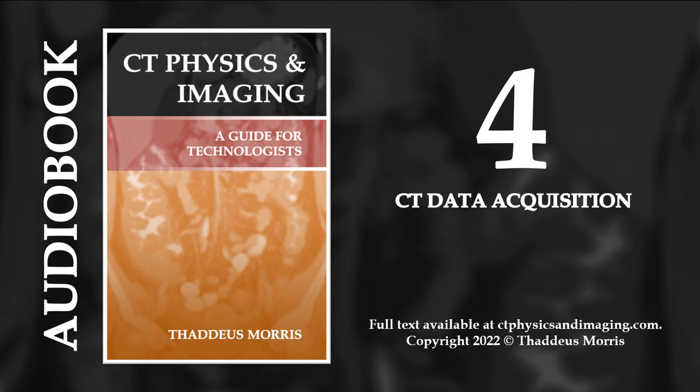So how is this possible? There's no special technology except that the detector array has to be large enough to include the entire organ being scanned. For example, Toshiba's 320 slice Aquilion 1 can easily collect the scanned data for the entire head or entire heart in just one rotation of the tube. The major benefit of volume scanning is rapid scanning with minimal motion.